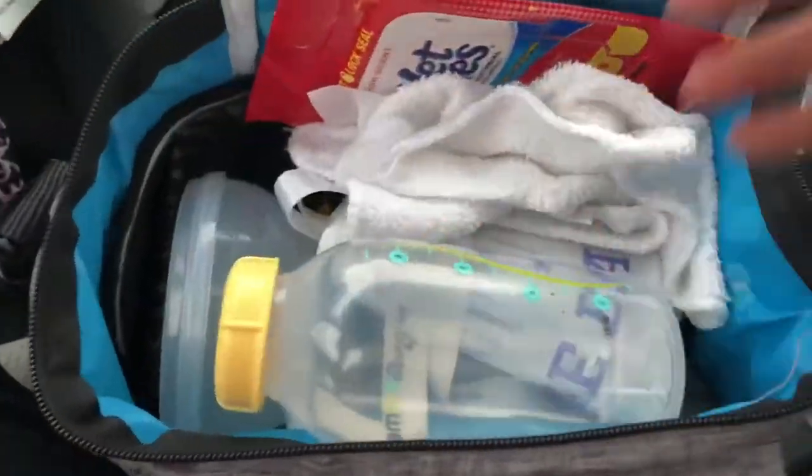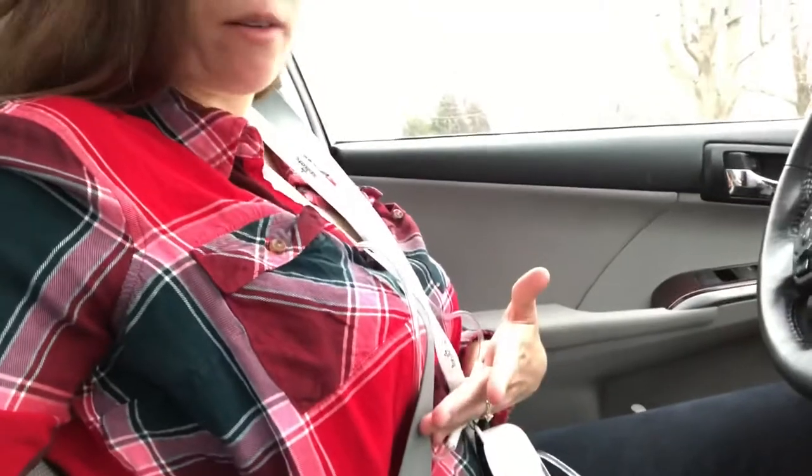This is me pumping right now — I'm pumping in the car and about to leave somewhere. My Baby Buddha pump and my Free Me cups — I feel like they make me look like Madonna, but it is what it is. I pour my milk into a plastic bottle to see how many ounces it is exactly, because even though the cups are marked with ounces, I feel like it isn't exactly accurate. To get the same measurement each time, I pour it into a baby bottle, and then from that bottle I pour into a plastic bag and label the bag.